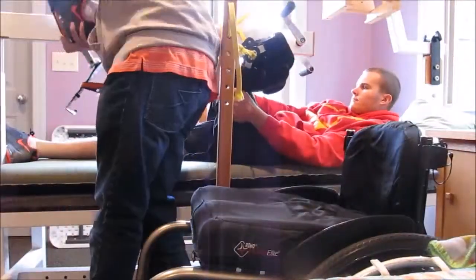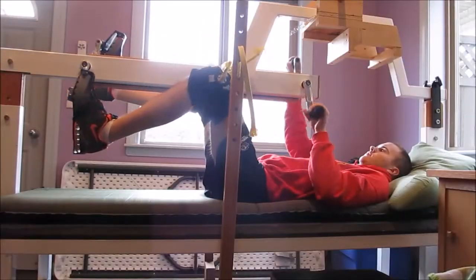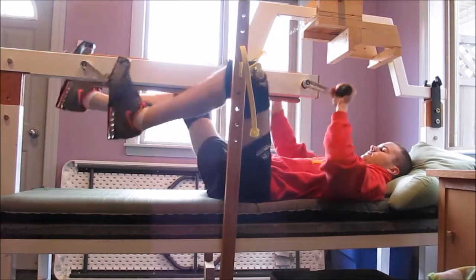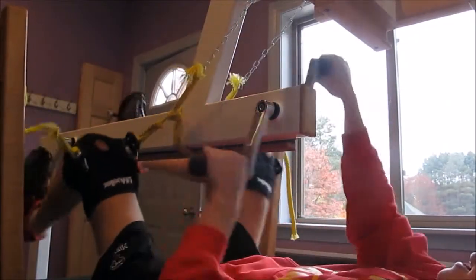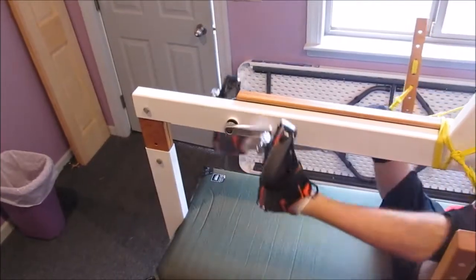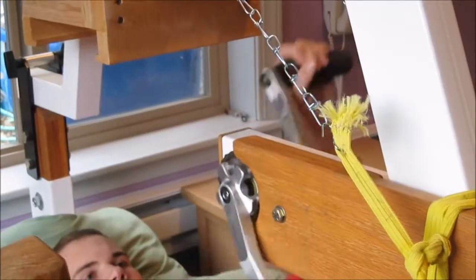So this is the Fisbee Wisbee, and the main purpose of it is to get the nerve signals to my spine and my brain, because I pedal with my hands to pedal my legs. It helps with the nerve connection, and it's also important for keeping my legs loose and just keeping them moving around. It's actually a really good workout for my arms as well.